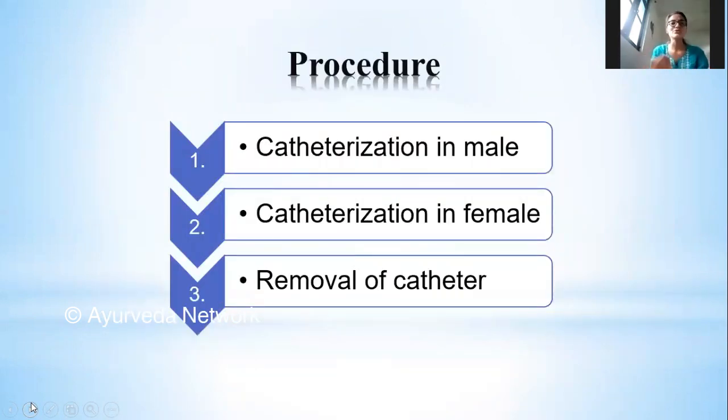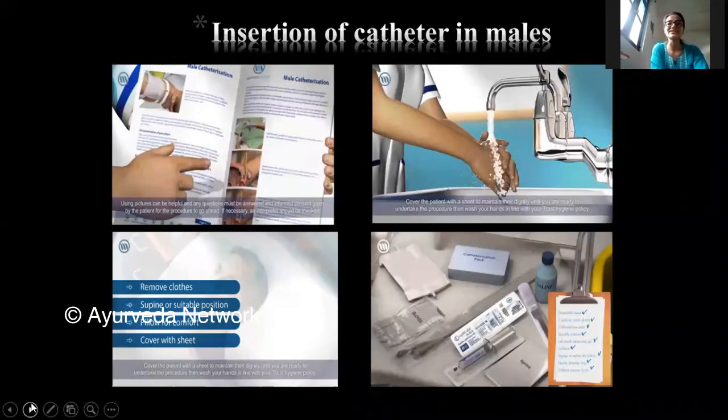Okay. Now, in the following slides, we are going to do a pictorial study of the procedures of catheterization in male, catheterization in female, and removal of catheter. So first of all, we'll start with catheterization in male.